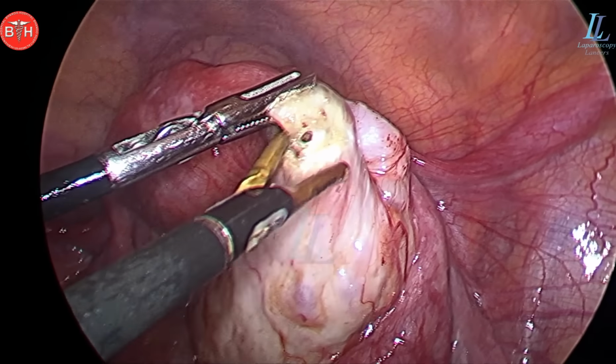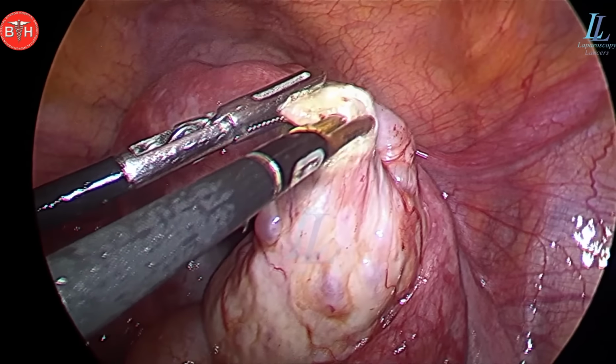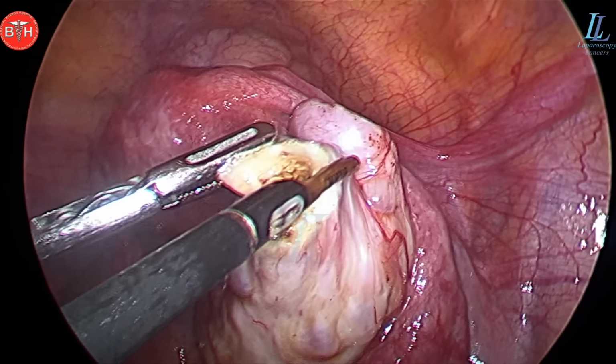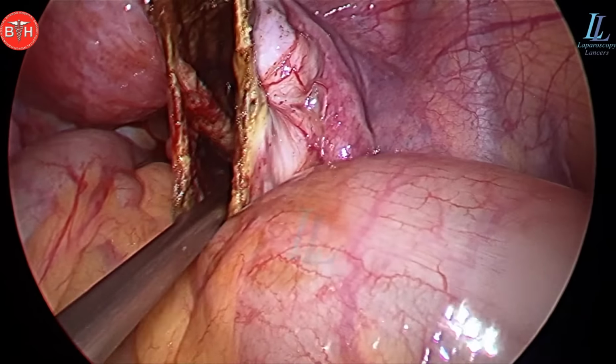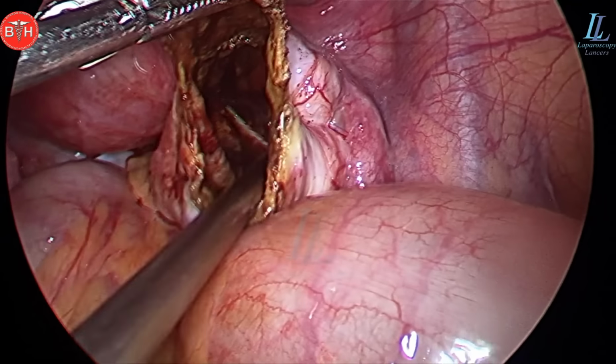The symptoms, the menstrual pains, and there you can see I have opened the cyst, aspirated and opened. I'll be using bipolar shears only over here, as it is a very safe and a very good instrument. There I have opened it, sucked out all of its contents so as to avoid spillage. Minimal spillage should be there.